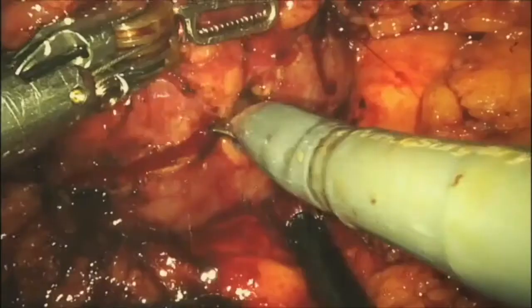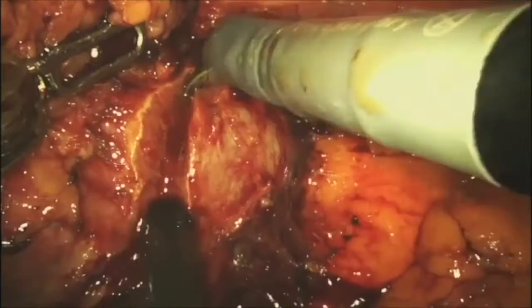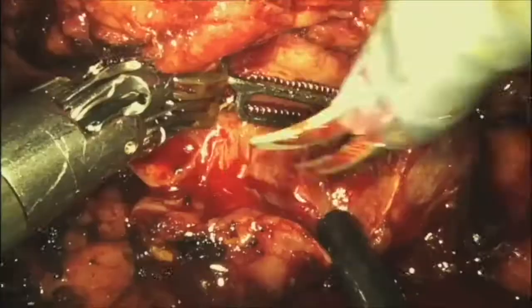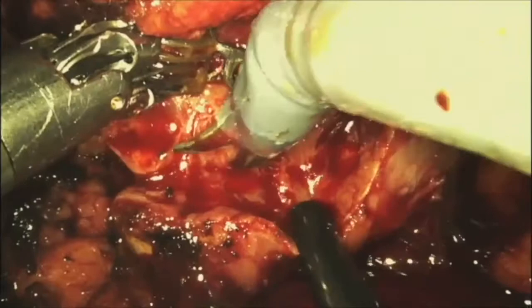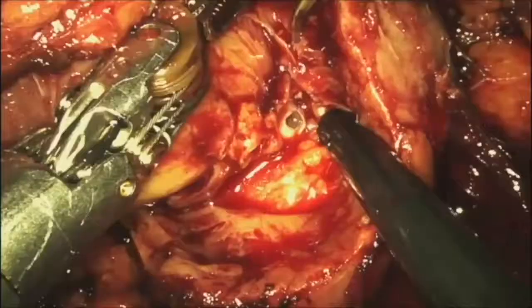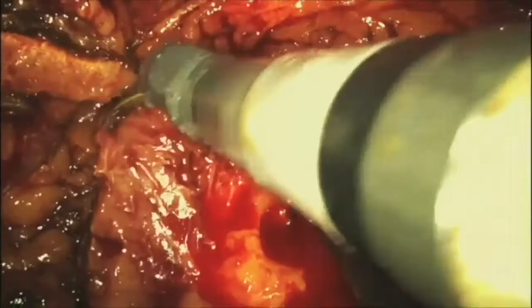To demonstrate the technique of tumor resection, a 4.5 cm left anterior mass is excised by Dr. Bufi. Tumor excision begins by separating the tumor from the normal renal parenchyma using sharp dissection with scissors. The tumor is elevated with the surgeon's non-dominant hand and the assistant provides counter traction by retracting the kidney in the opposite direction. As the deep margin of the tumor is encountered, the scissors are rotated to accommodate the contour of the tumor.